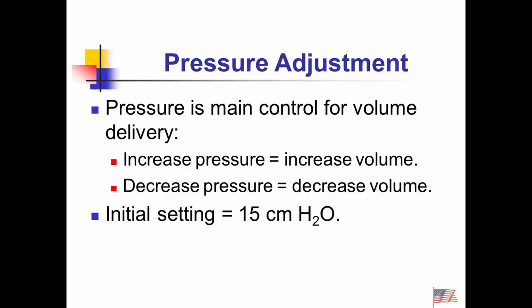Pressure is a control that's on the right-hand side of the unit, and when you play with it, you'll end up seeing it. But we're going to start at a pressure of about 15. What a novel idea, 15 and 15. And that's going to allow us to cycle the breath, end the breath, stop the flow when the pressure in the circuitry reaches 15 centimeters of water.